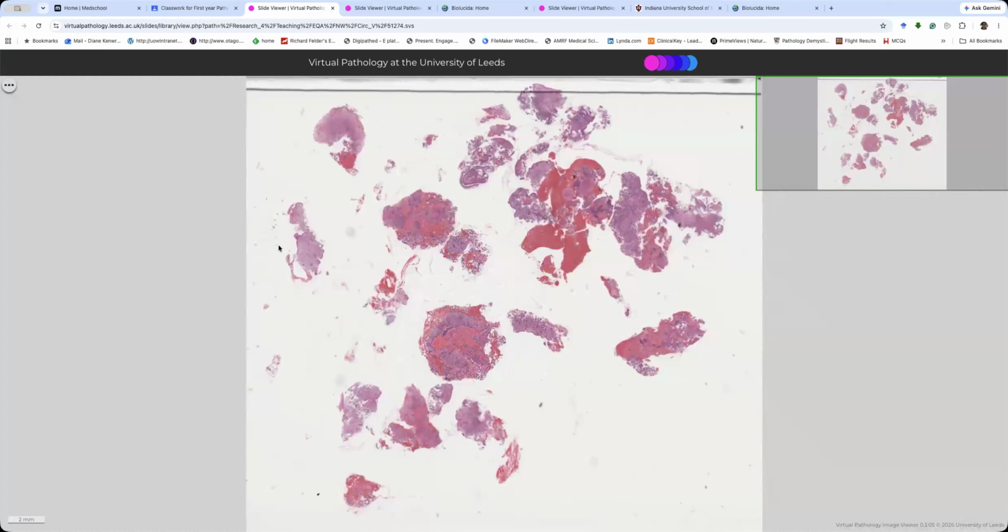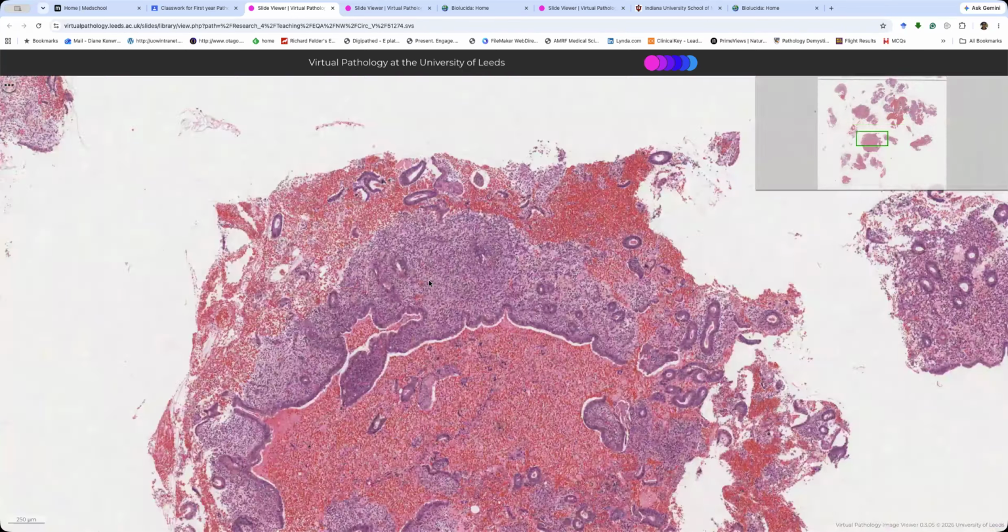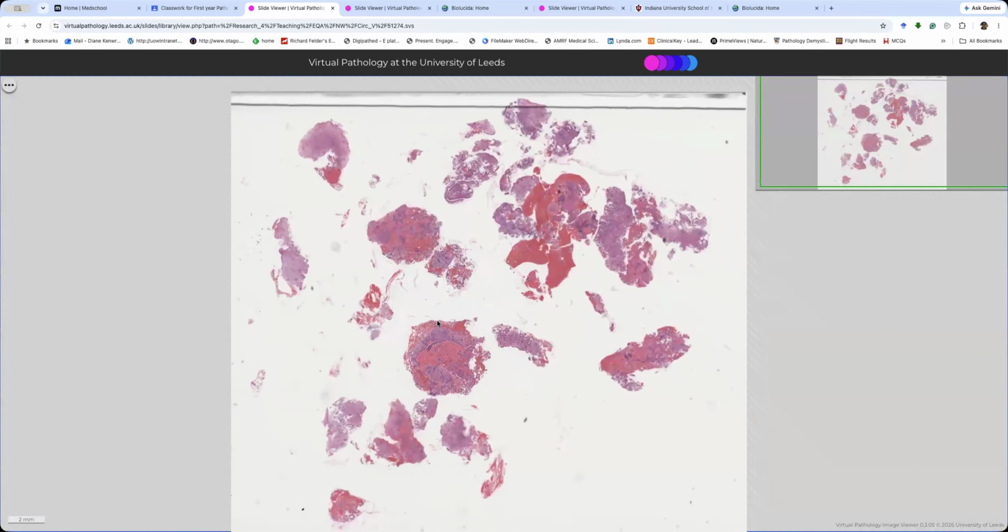But you do get chronic endometritis with foreign bodies like coils in the myometrium. I had one the other day. It had been in for 21 years and had massive squamous metaplasia and also cancer that was very squamous. And I just wonder whether it had that. So right, approach this sensibly, Diane, and do not dive right in. So low power scan suggests that there is no cancer.